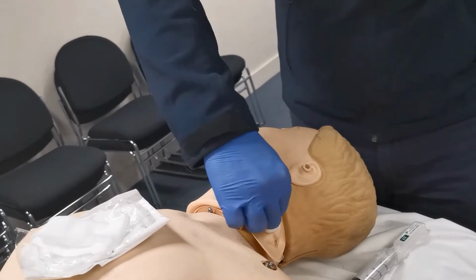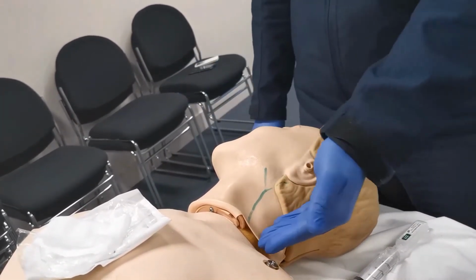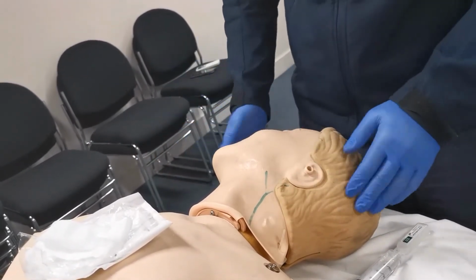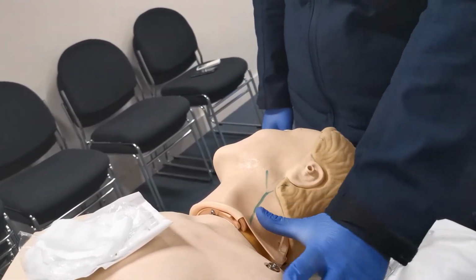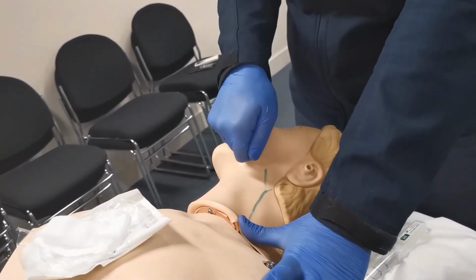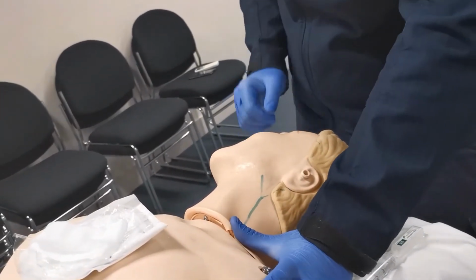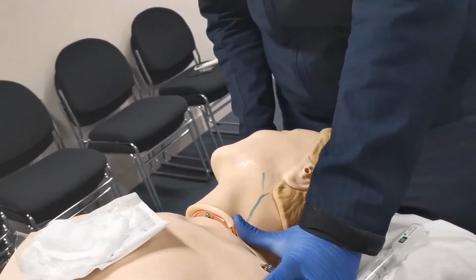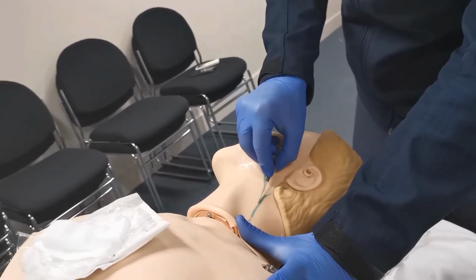Once you've located your insertion and prepared your patient, you can begin. Appropriately clean your insertion site as per your local state's guidelines and allow to air dry. From here, we need to increase the JVP further. We can't apply a venous tourniquet as per normal, otherwise you would choke your patient. So there's a few ways you can go about this. You can enlist the help of a partner to use their thumb and apply gentle pressure to engorge the vein. I personally don't like this because it will increase the risk of needle stick injury. What I like to do is use my own thumb to apply that pressure and also allow me to stabilise the vein. From here, using the appropriate cannula size, go in as per normal to ensure you get flashback.